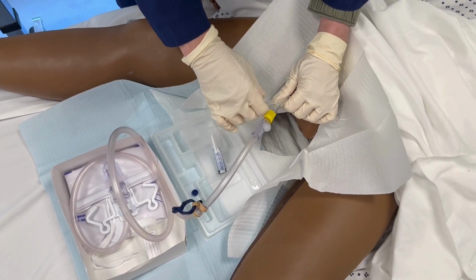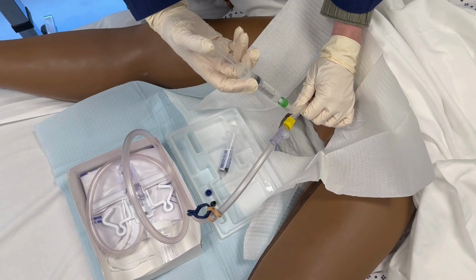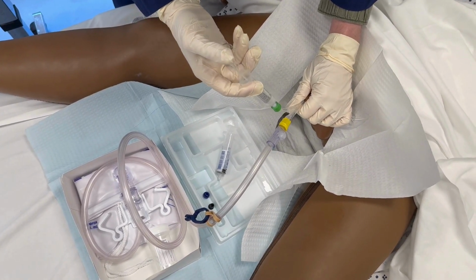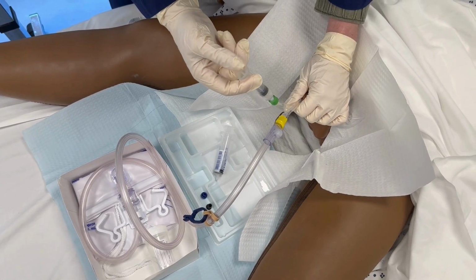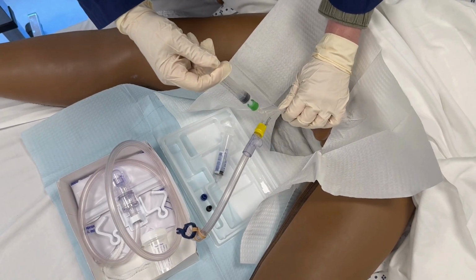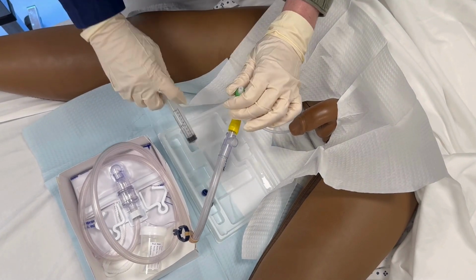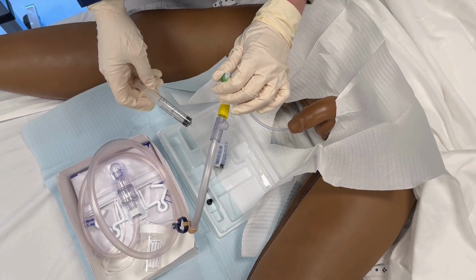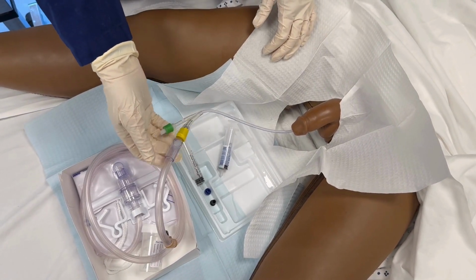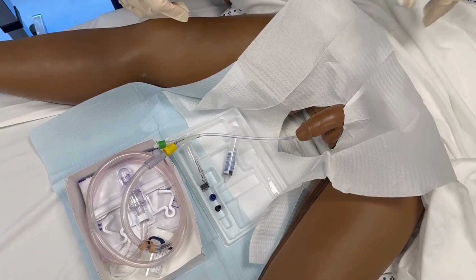Without removing your non-dominant hand, pinch the catheter securely at the meatus with your thumb and forefinger. Use your sterile dominant hand to fully inflate the catheter balloon. Using your non-dominant hand, gently tug on the catheter after the balloon is inflated to check for resistance. Replace the foreskin if present. Remove the syringe from the port. Remove and discard equipment.